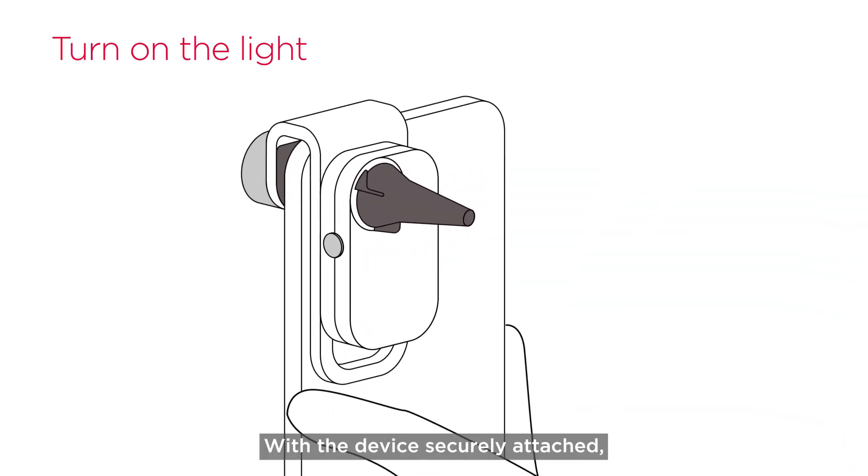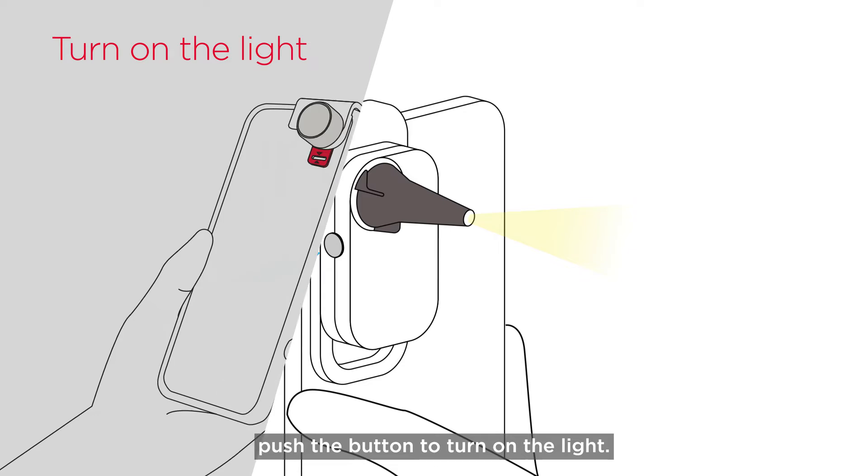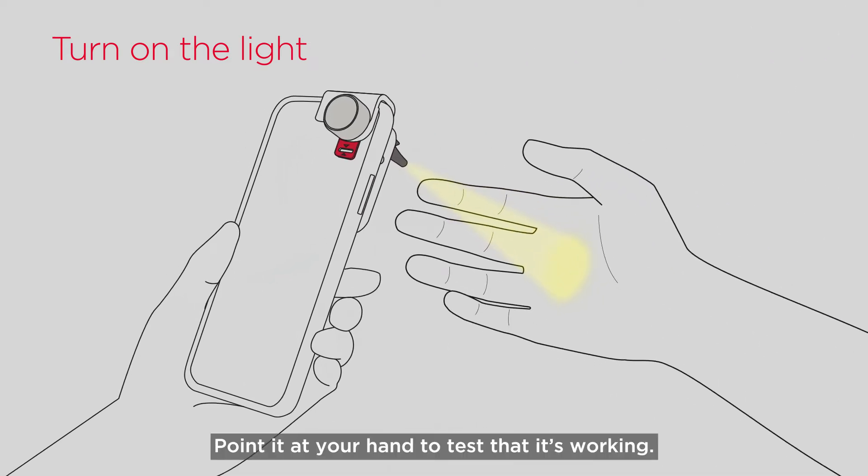With the device securely attached, push the button to turn on the light. Point it at your hand to test that it's working.